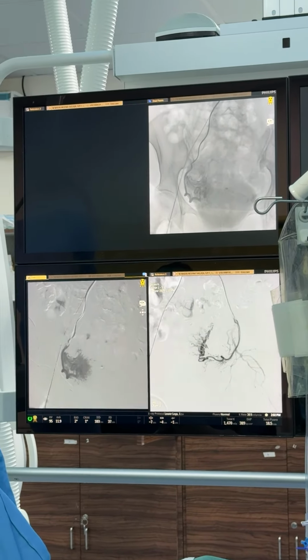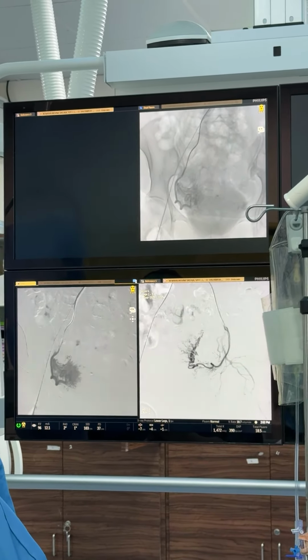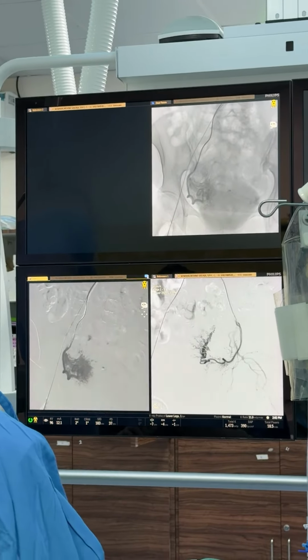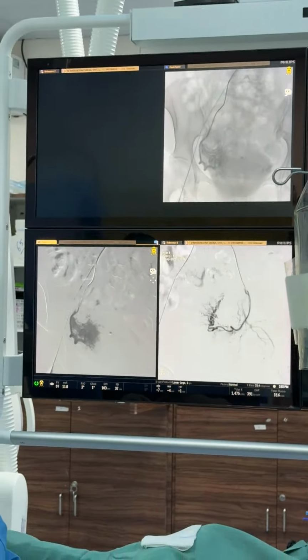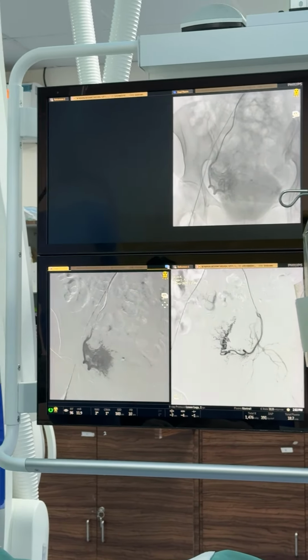I am quite happy here. You're going right there where it is absolutely necessary.